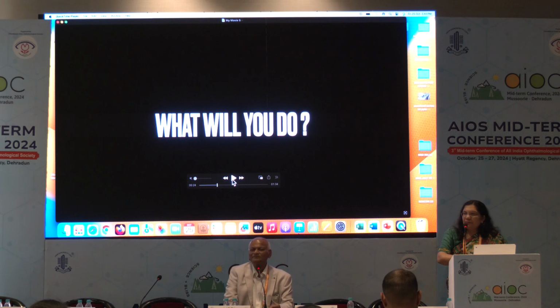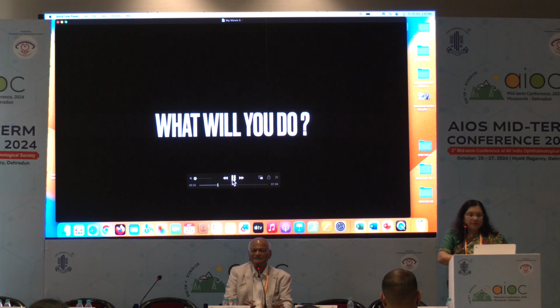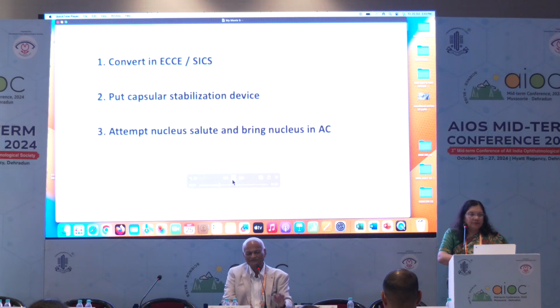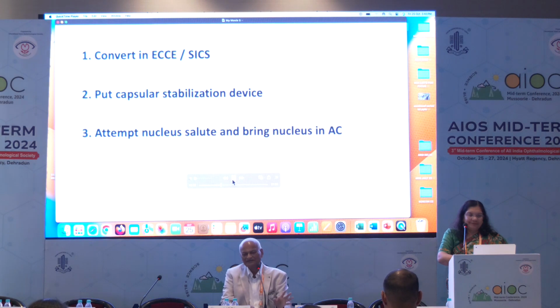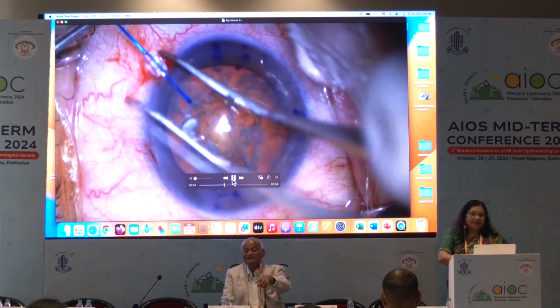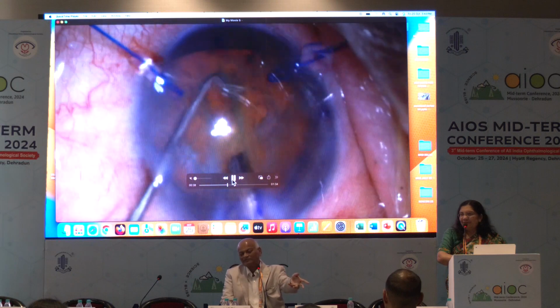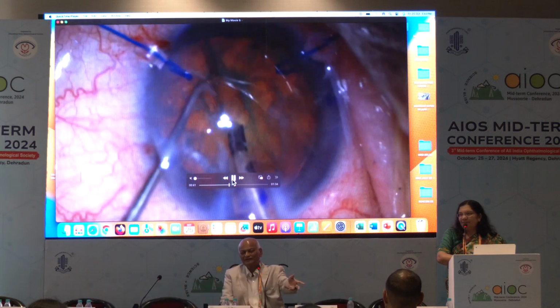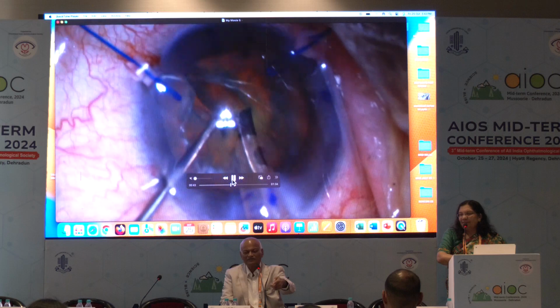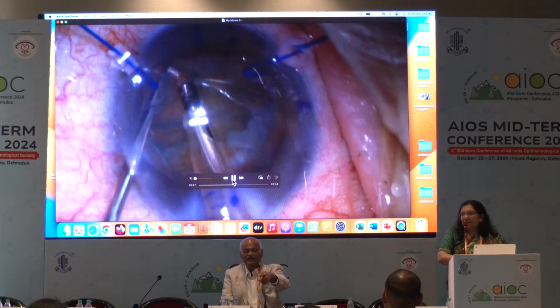And so every time it should not be an ideal thing; we should see the result. And for the result, now go ahead. So madam has, see, we have got very practical experience. Put a capsular stabilizer device and see here now. What I am doing, I am stabilizing, but this is an iris hook. This is not a capsular hook, because at that time it was not in my armamentarium in my OT. And so I have put an iris hook. And once I have put an iris hook, you will see now how I am doing.